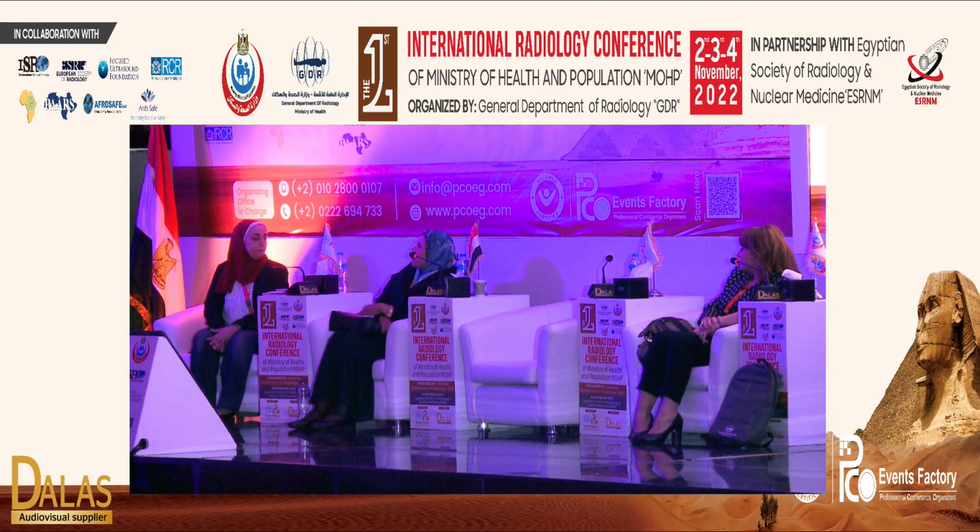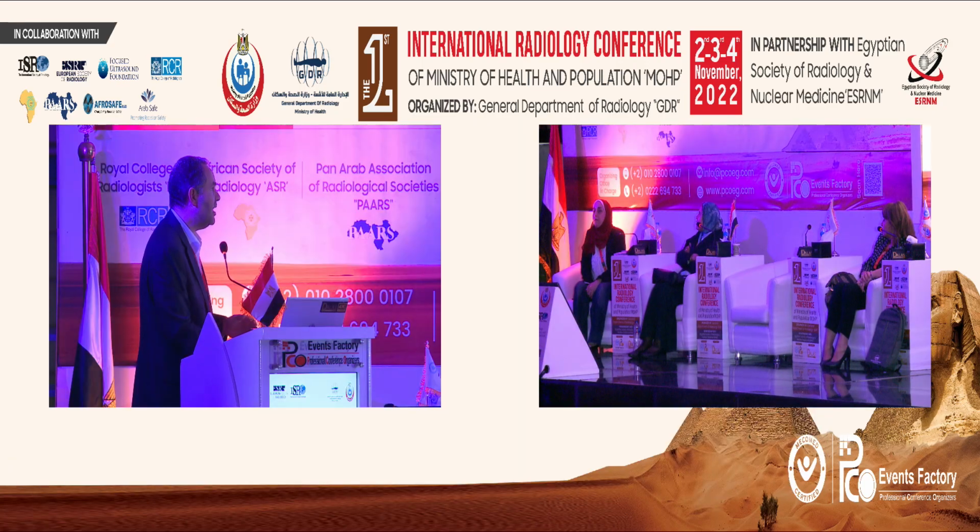I would like to ask you a question. With all these imaging modalities, is there still a role for barium meal follow-through? Yes, the need for fluoroscopy has significantly decreased. Mainly nowadays we do it for swallow studies, for patients who have aspiration. Around 50% of our daily cases are swallow studies to see if the patient is aspirating or not.